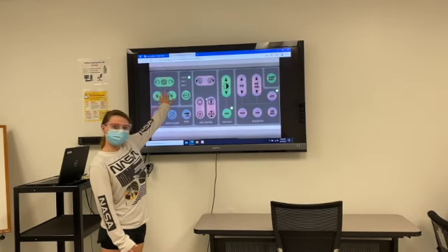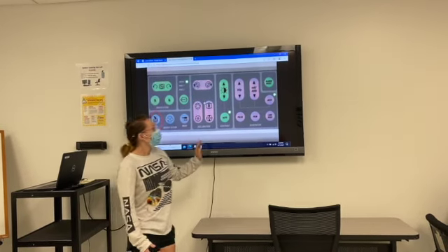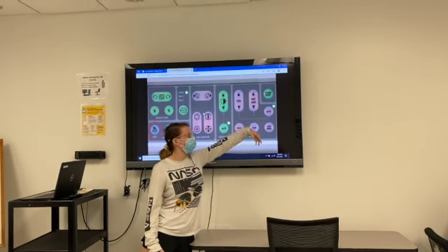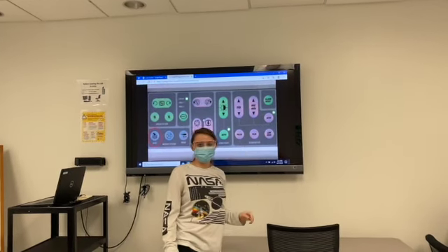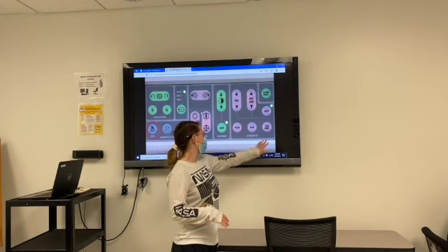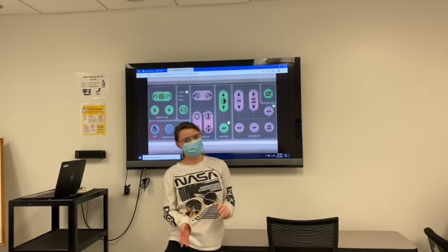These buttons change the orientation of the film on the display monitor. So these mirror while this one rotates it side to side. These control your exposure factors. You can increase the kVp or the mAs, which decrease or increase the patient exposure. The alarm reset is for when you have 5 minutes of cumulative fluoro time, and an alarm goes off to let you know that you're exposing the patient for 5 minutes, and then this resets the alarm. And low dose changes the fluoro to where the contrast is a little bit less, but the dose to the patient is also less.